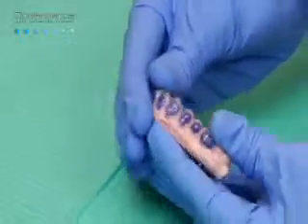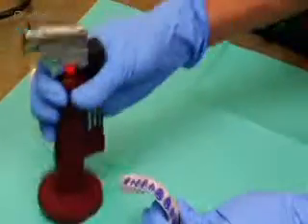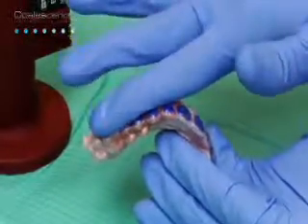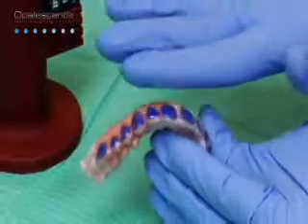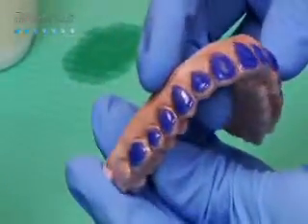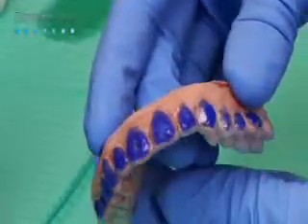Check all tray extensions. Gently flame polish the edges, one quadrant at a time. While still warm, hold the periphery of each segment firmly against the model for 3 seconds with a water-moistened finger. If an area is short of the desired length, gently heat and push the tray material to the desired location. If this over-thins the tray material, a new tray should be fabricated.